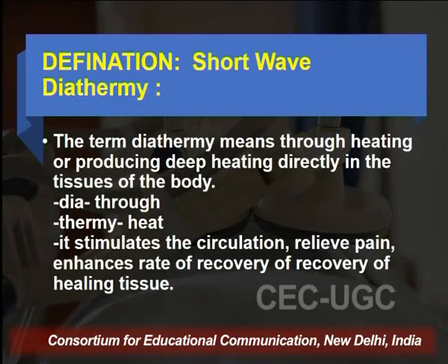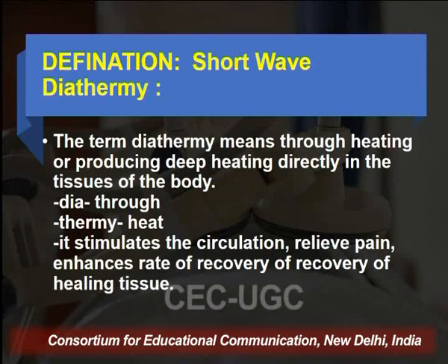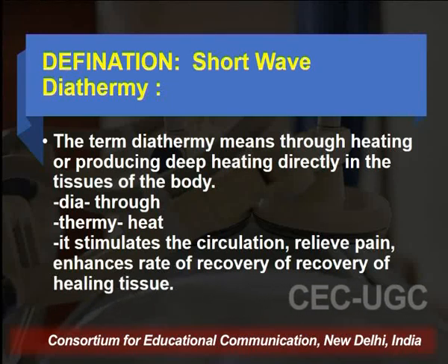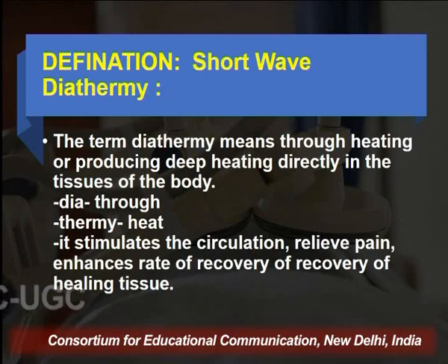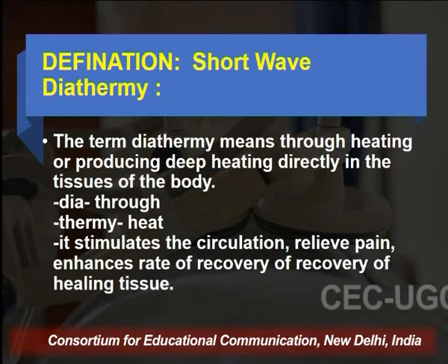So, let's discuss the definition of short wave diathermy. So, the term diathermy means through heating or producing deep heating directly in the tissues of the body. So, dia means through and thermi means heat. So, it stimulates the circulation, relieves pain, enhances rate of recovery of healing tissues.